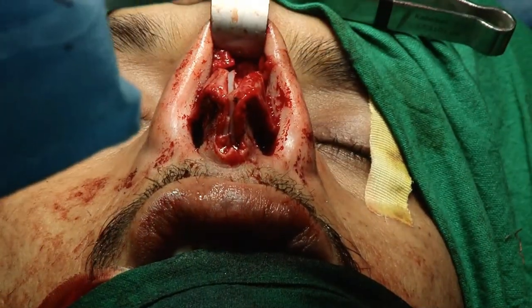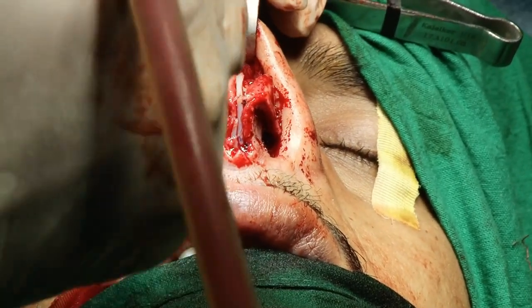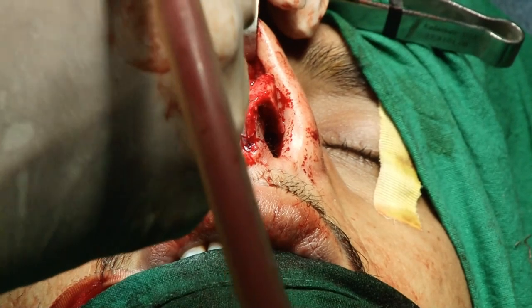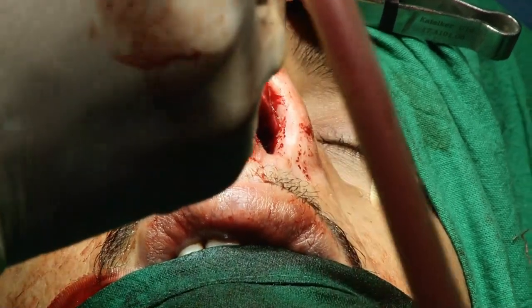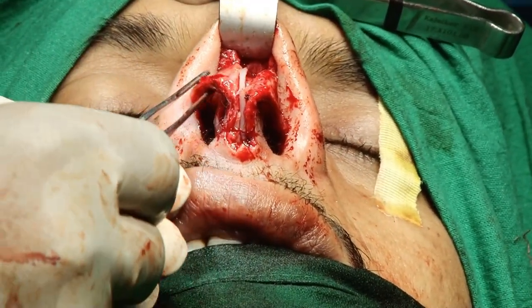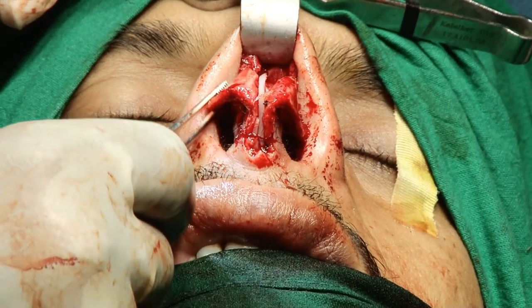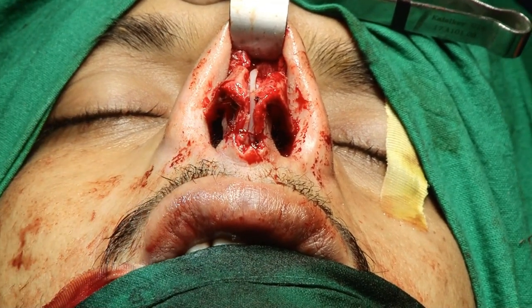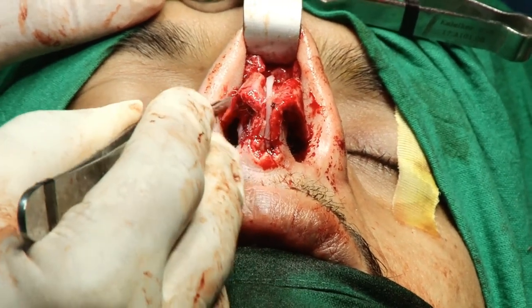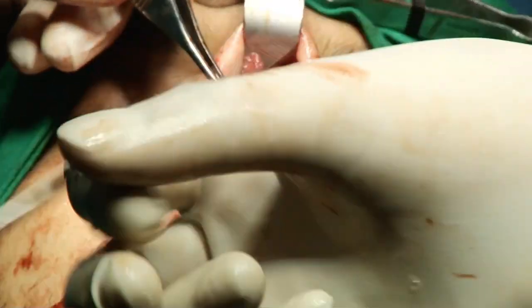So basically this case is a crooked nose, typical crooked nose with a badly deviated septum. I reconstructed this septum after excision of the deviated part of the septum. Now the septum is in the midline, I reconstructed the anterior deviated part, and on examination there is a little bit of depression here. This lateral crus is not diffusely changed, so I just put a lateral crural underlay graft on the underside of this.